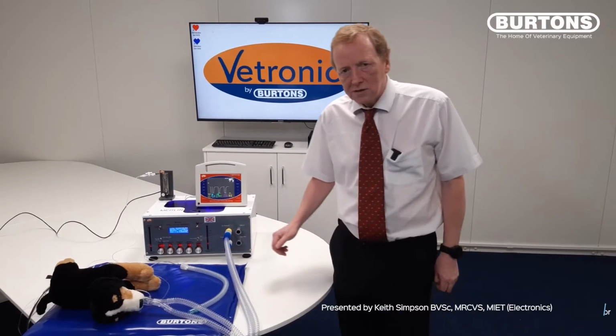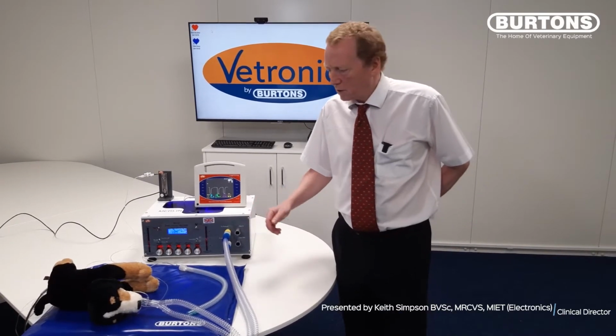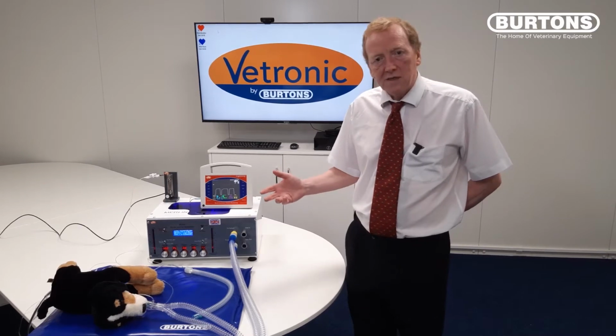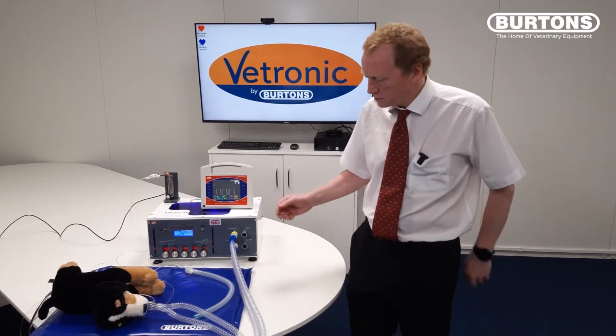We're now going to look at the concept of dead space in regards to our manikin and our ventilated animal. We would expect dead space to have an effect on the minute volume ventilation, in particular to reduce the alveolar minute volume ventilation. And if we do that, we would expect to see a rise in our end tidal CO2.